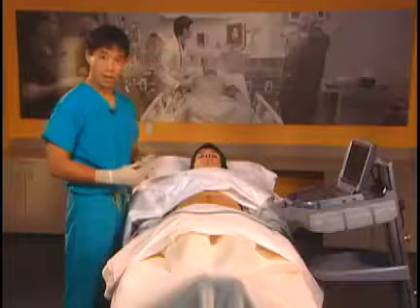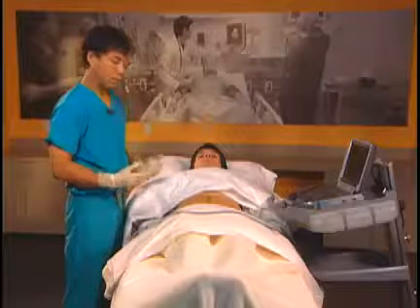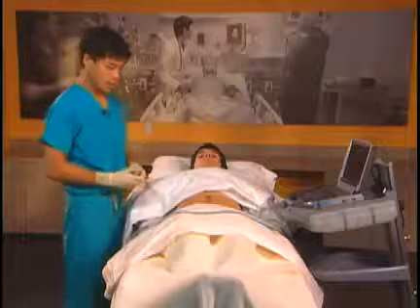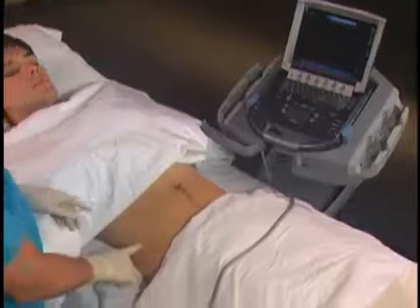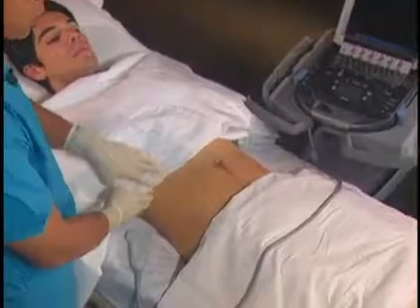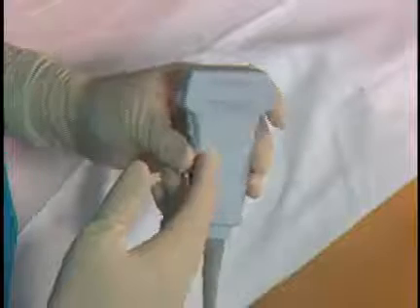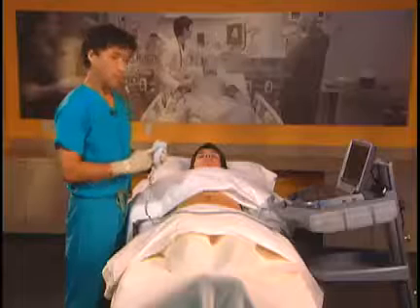In order to find these landmarks, we should position the patient properly. We have the patient completely supine, exposing the iliac crest and the costal margin superiorly. We use a linear probe for these blocks with a frequency of 5 to 10, set in the general or penetration mode.